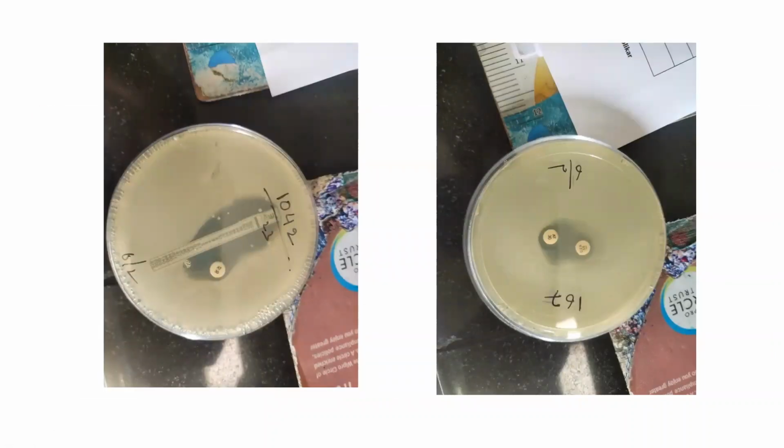Yes, this is fine. In the second picture, I'll show you the first thing. You can see two discs. On one disc there is written AT, that is the aztreonam disc, and on another disc there is CZA, which is basically ceftazidime and avibactam. If you see around them, there is a very small zone. There is not much zone of inhibition around them, but there is a synergism present. Between them there is no growth at all. That's when you call the drug individually resistant, because there is not much zone, but though they are far away, the area between them is clear. There is no bacterial growth. That's when you call it synergism present. That's one way to test it.